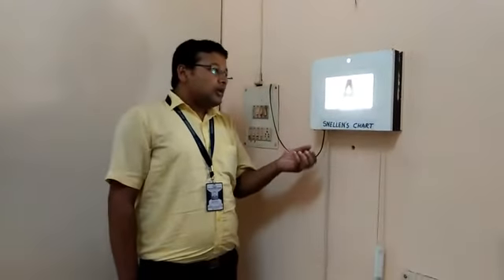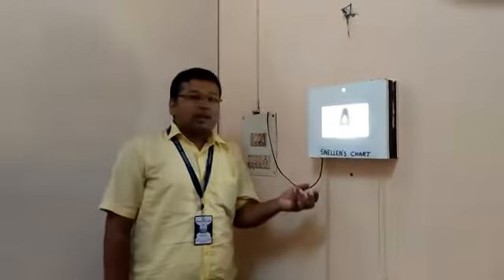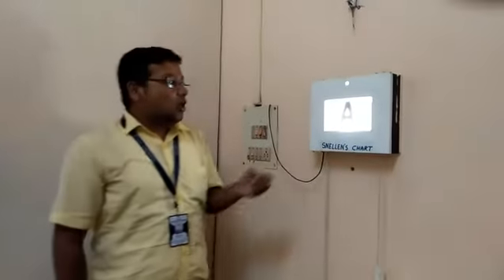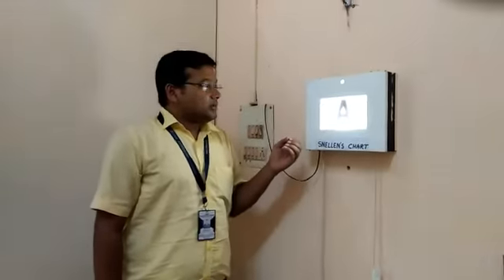If vision is improved after putting pinhole, it indicates the patient has refractive error. Or if vision is not improved after putting pinhole also, it indicates the patient has some other ocular pathologies like cataract, retinal detachment, ARMD, diabetic retinopathy. That means with the help of visual acuity testing, we can differentiate whether the abnormality of vision is because of a refractive error, which we can correct with specs, or because of some other ocular pathologies. Now I will discuss how to check visual acuity of a patient.